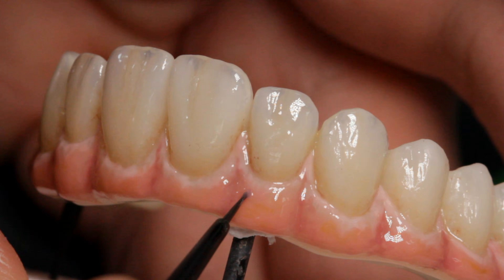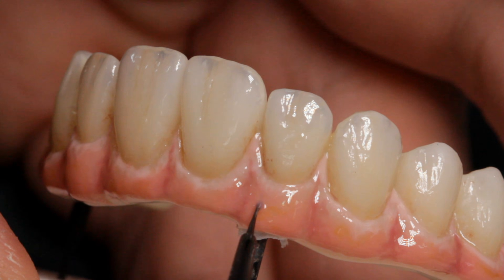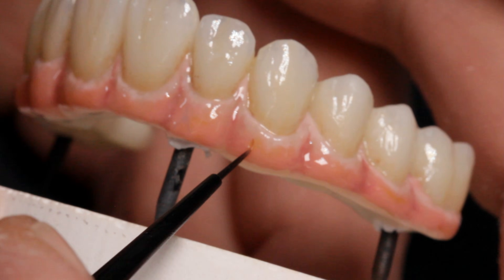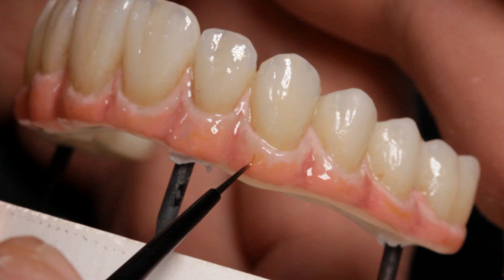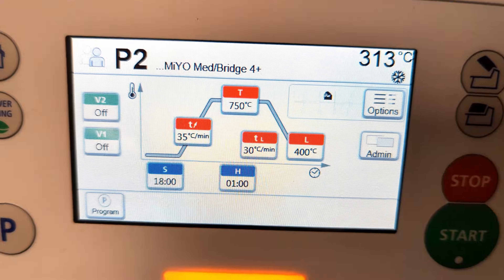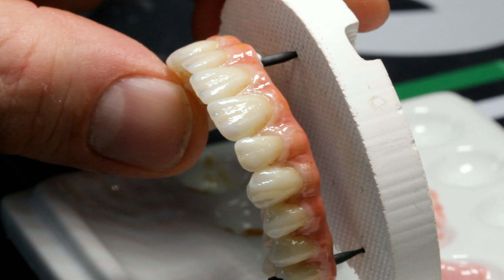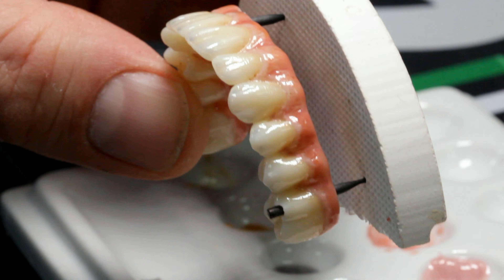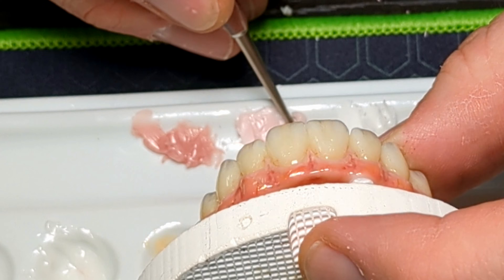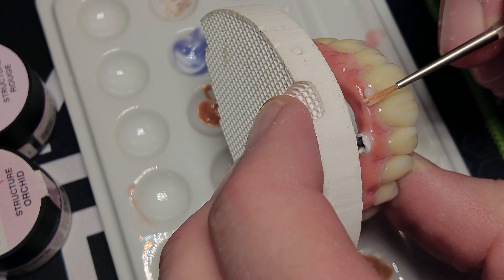Midnight Blue and Fissure make great veins — apply them in a swirly line with branches, but more is less so don't overdo it. To fire the pink, I use the same firing cycle as before and get a great result that is acceptable in most cases. If you want to bring your work to the next level, you can add some structure to the gingival. I am using only Orchid for the structure to cover most of the facial gingival.